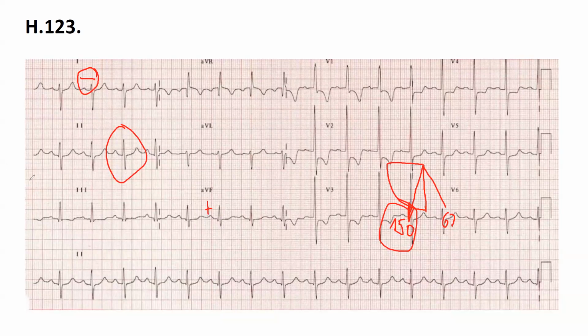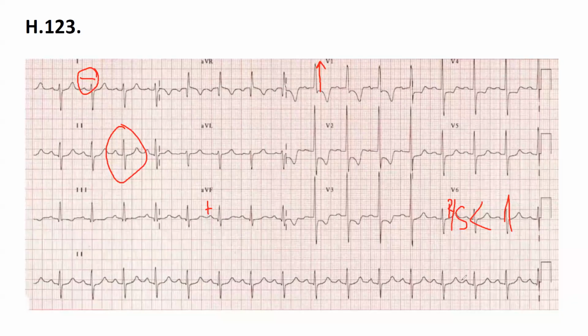Next, pathological Q waves, I guess. No pathological Q waves. Okay. I'm not sure.